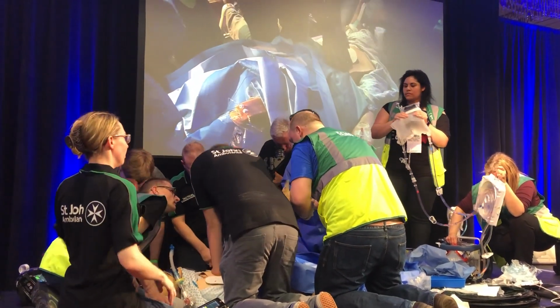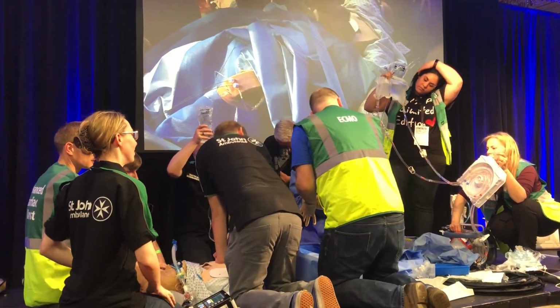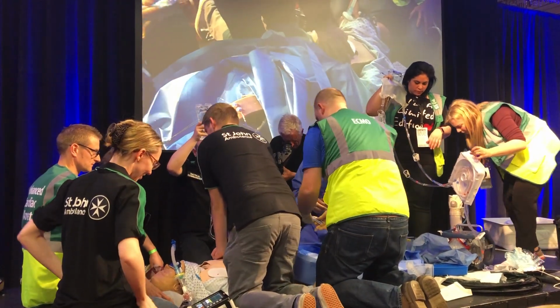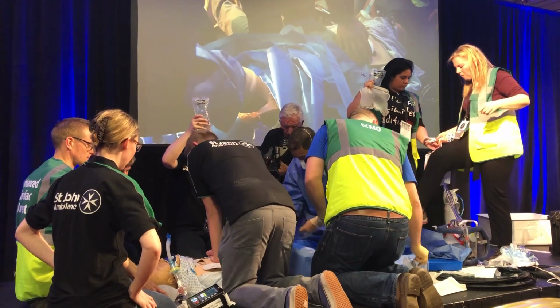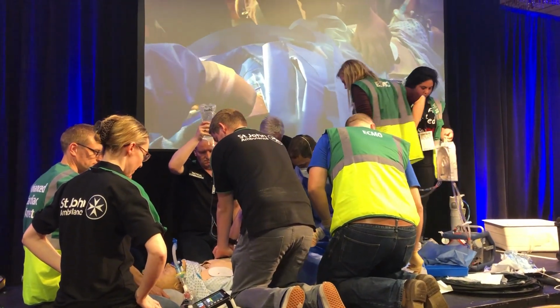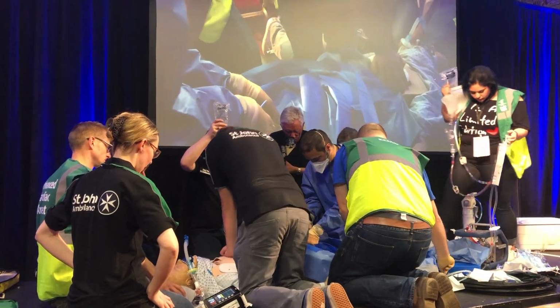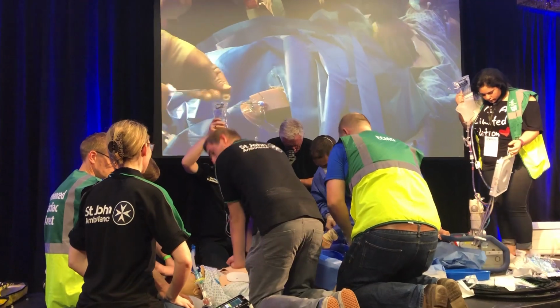We'll give a bit of heparin, so you might hear us ask for a bit of heparin. The reason being that what we don't want is clot to form around the aortic valve and in the root, and then prolonged CPR and low flow patients. That can happen quite quickly. And we don't want our circuit to clot, because that wouldn't be good for anyone involved. So you'll get a little bit of heparin at this point.